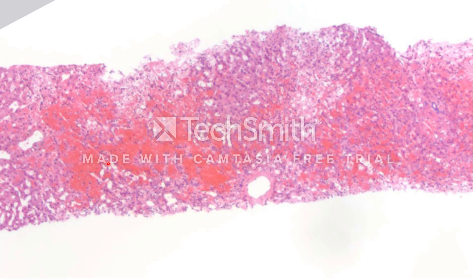This is liver, and it's somewhat hard to identify portal tracts, so I'll identify them for you. Here's a portal tract somewhere here, here's another portal tract somewhere here, and you'll notice that this blood that's accumulating is centered around the central veins, although it involves all three zones of the liver.